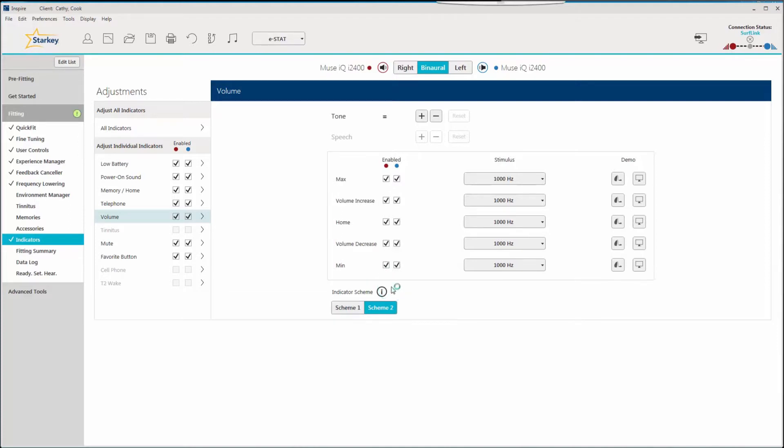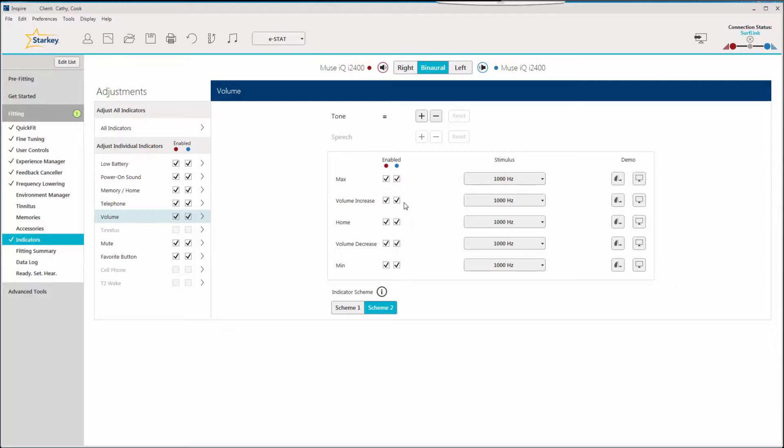Click on scheme two, which was also available in previous devices. It features one beep for minimum volume, two beeps for the next step which may be an increase or decrease in volume depending on how the user control is set, three beeps for the home setting, four beeps for the next step, and five beeps for maximum volume.